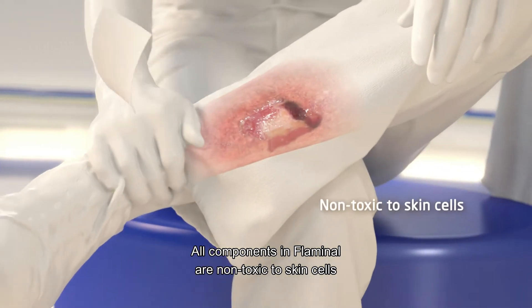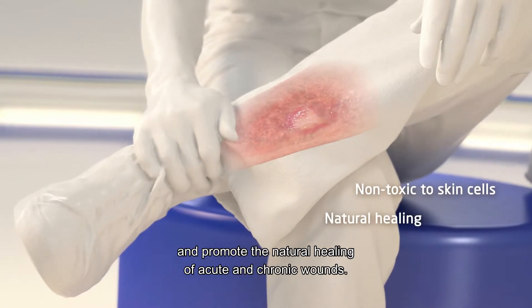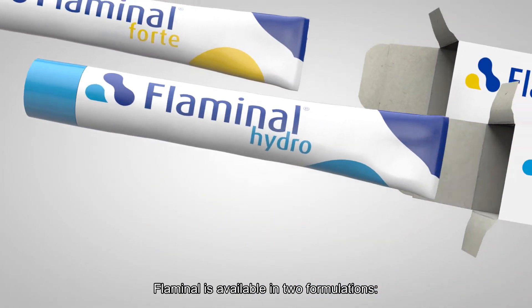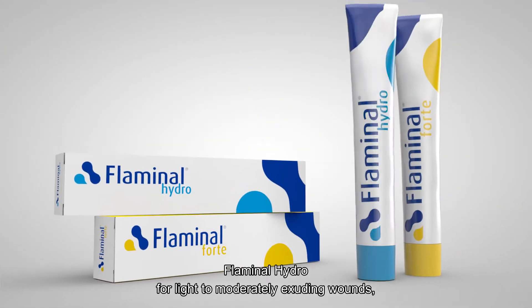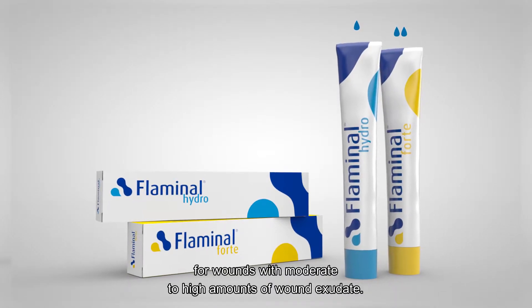All components in Flaminal are non-toxic to skin cells and promote the natural healing of acute and chronic wounds. Flaminal is available in two formulations: Flaminal Hydro for light to moderately exuding wounds, and Flaminal Forte for wounds with moderate to high amounts of wound exudate.